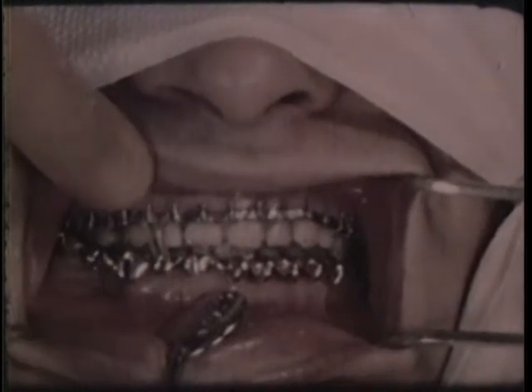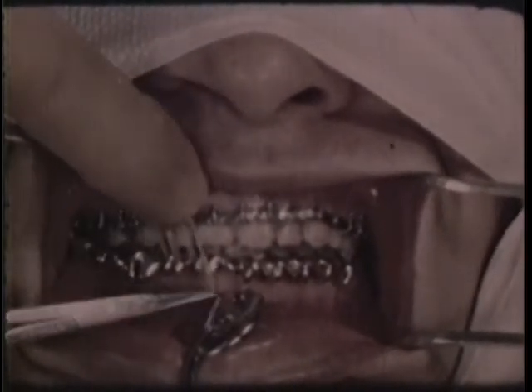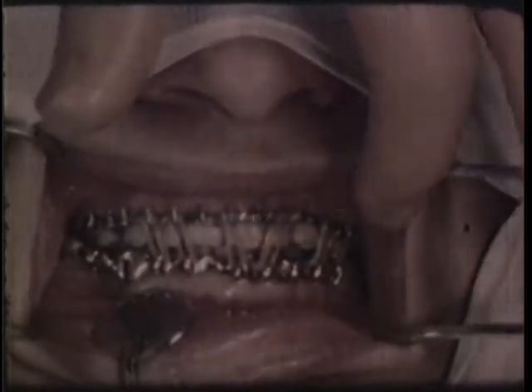With the appliance in place, some sidewise motion of the mandible is possible. Intermaxillary rubber bands laced over the hooks on the maxillary arch bar are placed during passive fixation. Rubber bands permit limited relaxation and easy liquid feeding during convalescent stages. Controlled fixation may be obtained if desired with steel wire. X-ray after reduction of the fracture shows the splint and maxillary arch in place with the lower border now on the same level as the frontal portion.